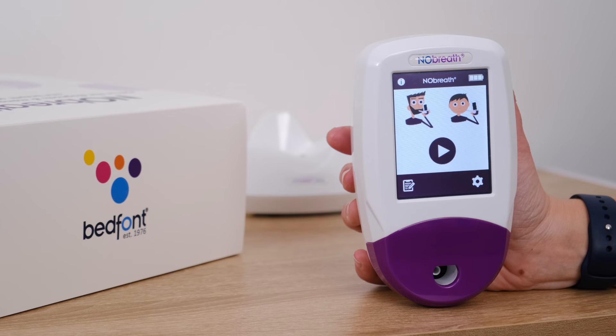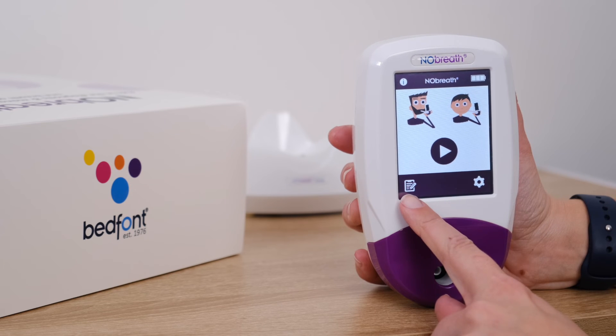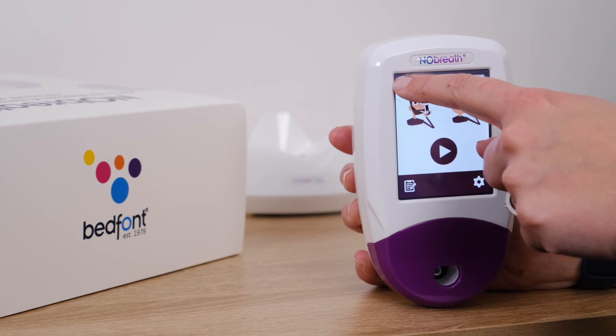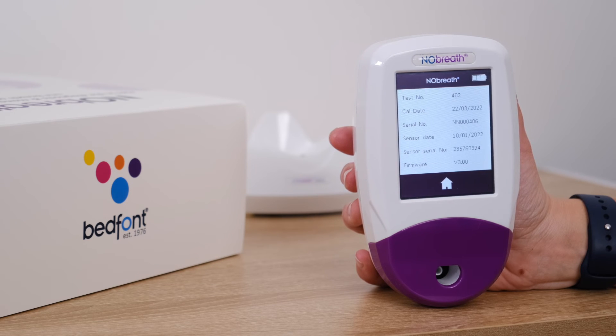Also on the home screen, we have information, the battery status, patient profiles, and the menu. Pressing I on the top left hand of the screen will open the information page. Here you will find the number of tests performed on this device, the date of last calibration, the serial number for this No-Breath, the date the sensor was changed, the sensor serial number, and the firmware version. You can exit this page by pressing the home icon.